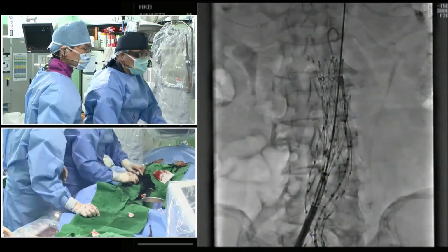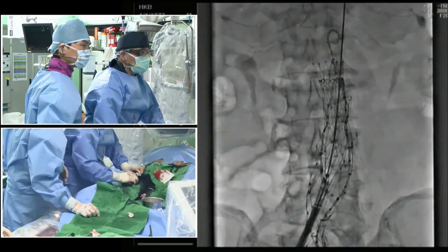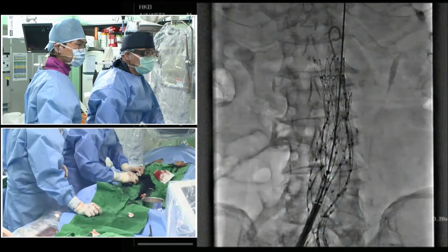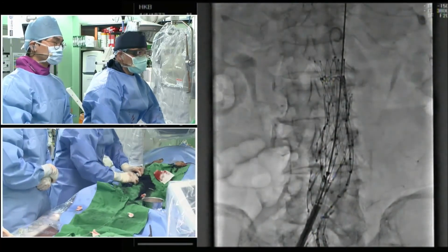Okay. So I then deploy the distal part of the graft. Do you want to take another picture first, just to be sure? Okay. Yeah. Make the audience happy. Okay, Cine. Yeah, that looks good. Okay. So Professor Cole, I deploy the distal part.